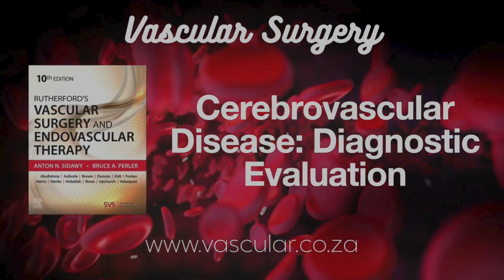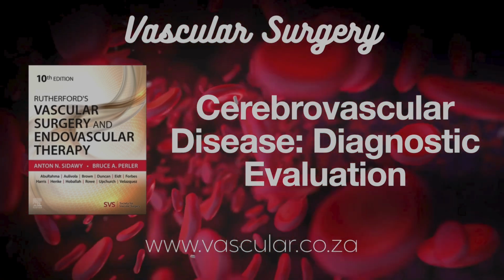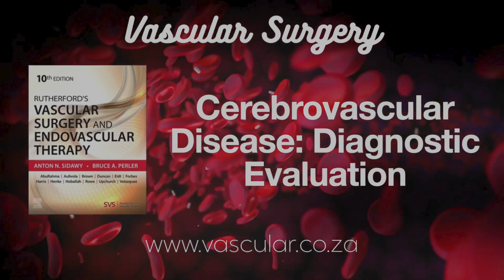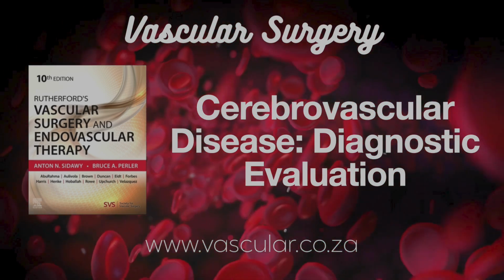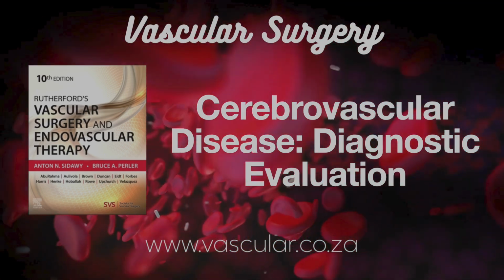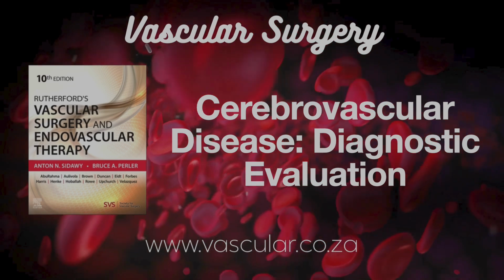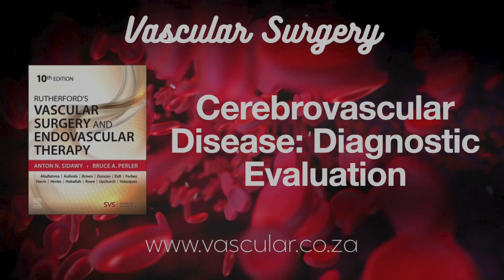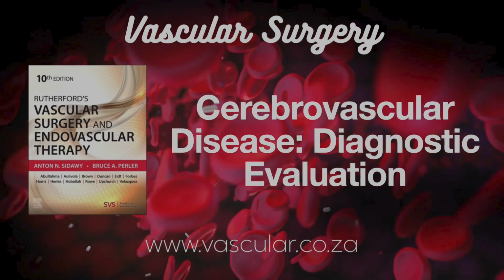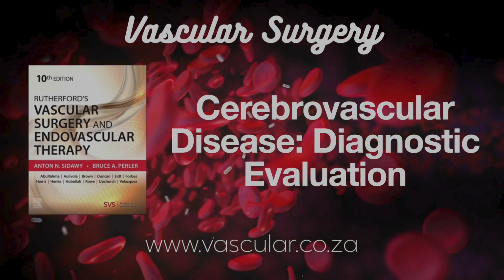Okay, let's talk about the one often called the gold standard, digital subtraction angiography, DSA. If DU and CTA are so good, why is DSA still seen as the ultimate benchmark? That's a fair point. DSA does still provide the absolute highest resolution, most detailed pictures of the blood vessels. But you're right, with DU and MDCTA being so good and much less invasive, DSA is really not needed routinely before surgery anymore. It's reserved for specific situations.